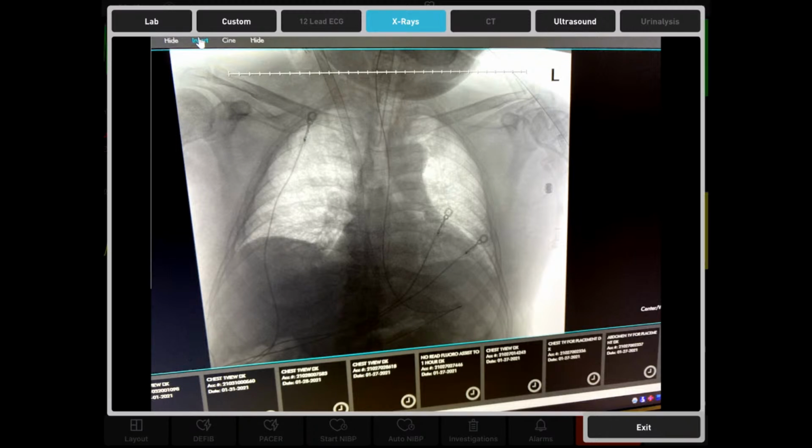And if you look at, I wish I could trace it, but I can't. But if you look at your ECMO cannula coming in from the right side of the neck going down, you see it as it leaves the superior vena cava. It's crossing the midline. It should be to the right of the spinal processes, and it's coming across midline, and that is either just above the tricuspid valve or possibly even in the RV. I've seen it deeper. That one there, the tip looks like it's still in the right atrium, but it is certainly rotated over, probably right above the tricuspid valve.